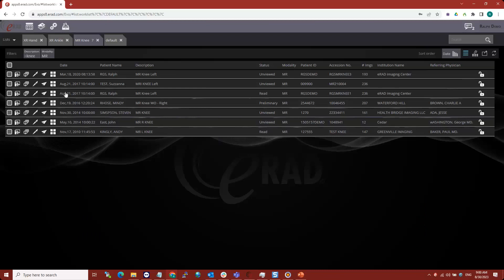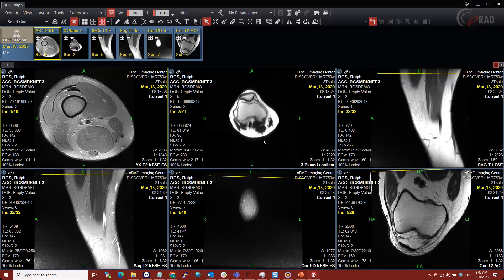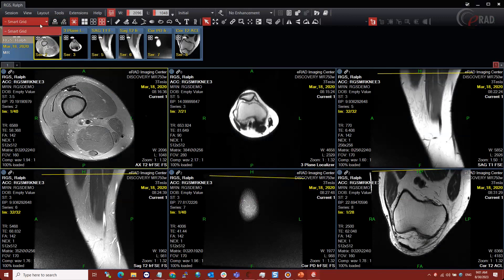The first thing I'm going to do is open up a study. We'll pick this MRI of the knee and open it up. I have a new user account set up here, so I don't have any hanging protocols built. Our hanging protocol selector is found up here on the top left, and we see we have something by default called Smart Grid. If I click the dropdown, I don't have anything else to choose from.